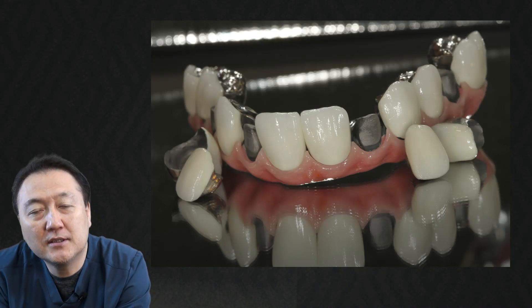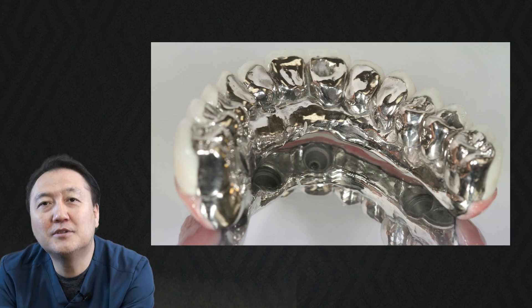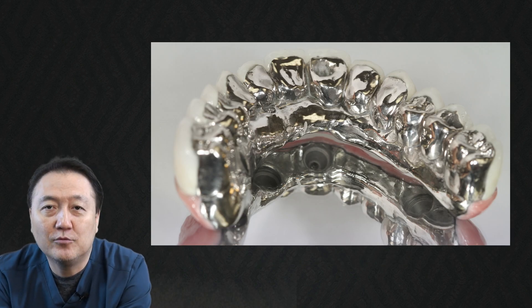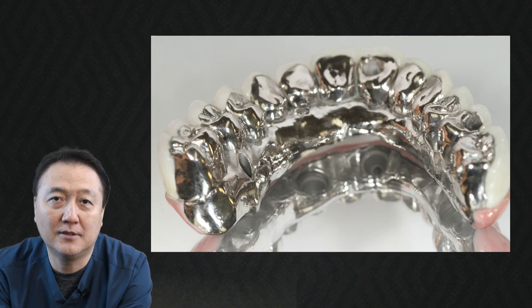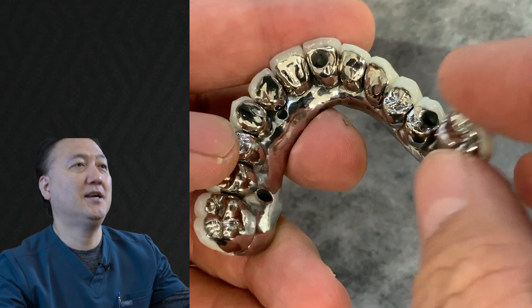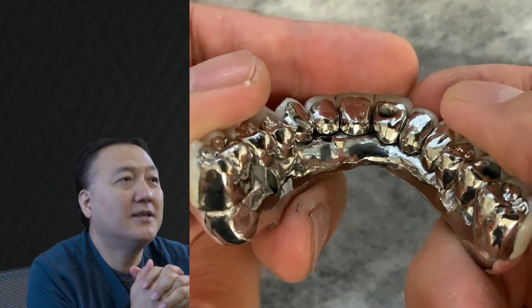The most interesting, most durable, most aesthetic, most longevity regarding full mouth implants, especially for heavy grinders — they break everything. Want to know how I made full mouth implants? Stay tuned.